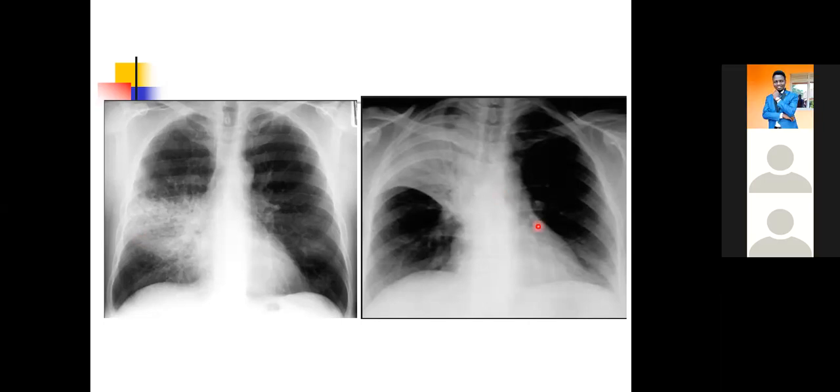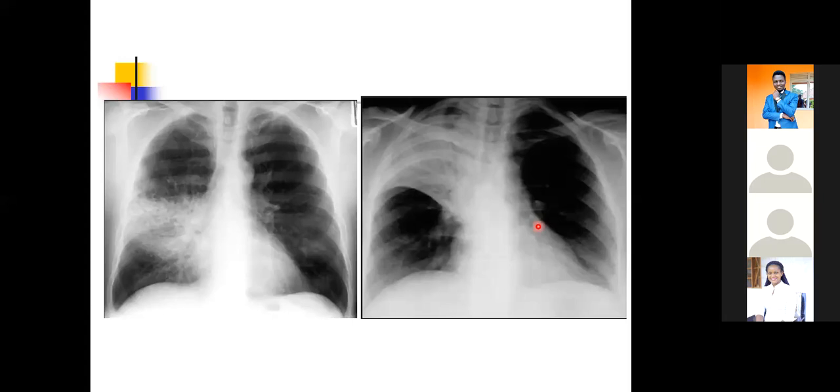Yes, Mercy? I beg your pardon, on the other sign, not the silhouette. The air bronchograms? Yes. I only asked you to look keenly within this area of opacity.